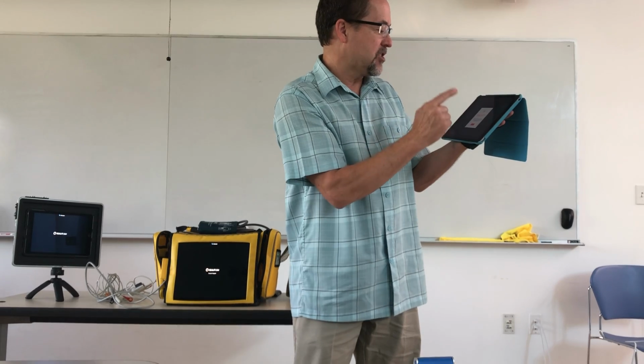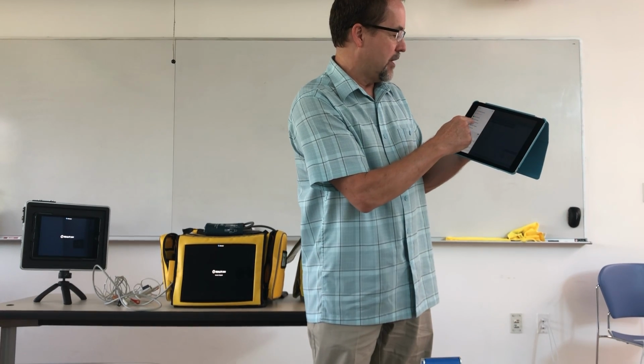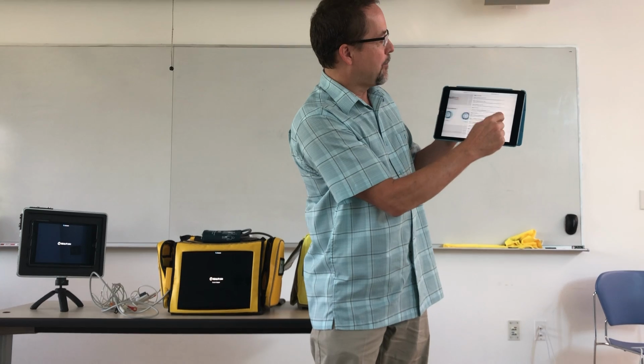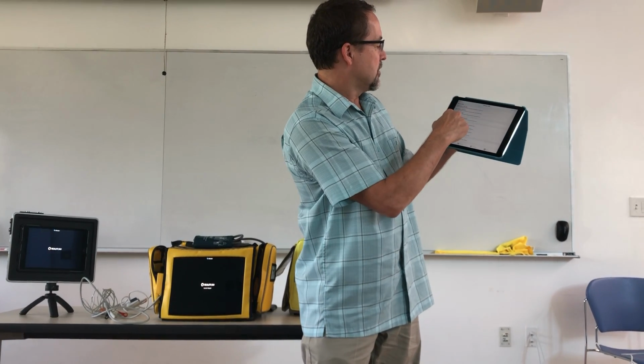And my data has been saved. The reports are now available in what they call the training management system. I say, okay, if I go back to the main menu here, there's this little TMS thing up here. And when I go there, the demos that we did today are all right there. So I've got a couple of them that I just did.